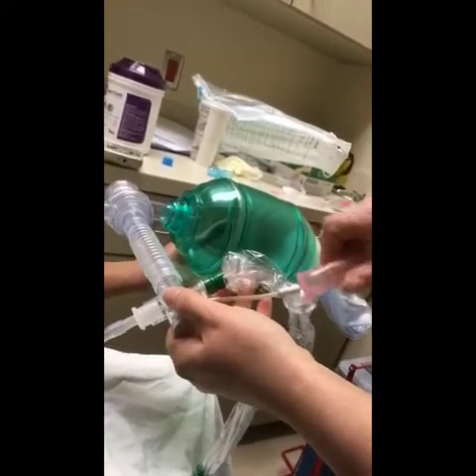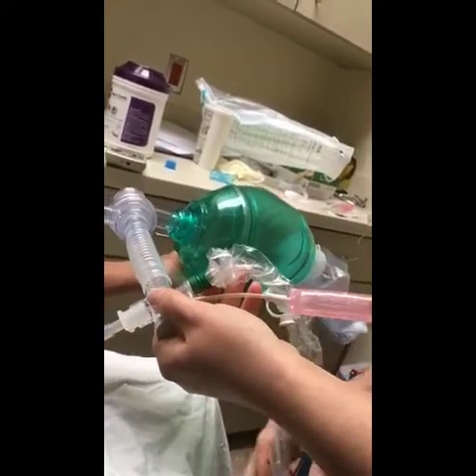Okay, so we'll go ahead and go down a little bit. Throw some saline down. Marcus, go ahead and bag. Good. Oh yeah, there it comes.